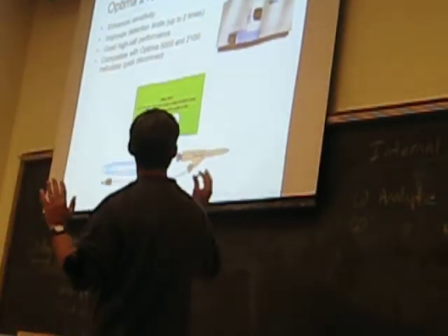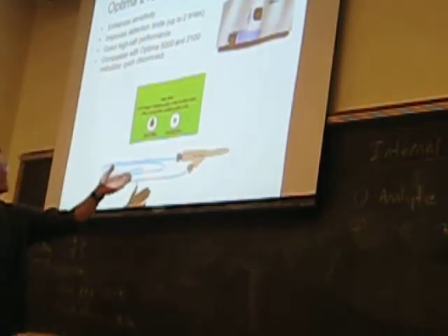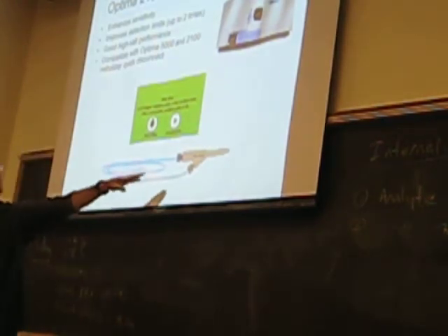It's got a special, this is not really important to us, but they've developed these different kinds of nebulizers. They call this one a Mira-Mist nebulizer.